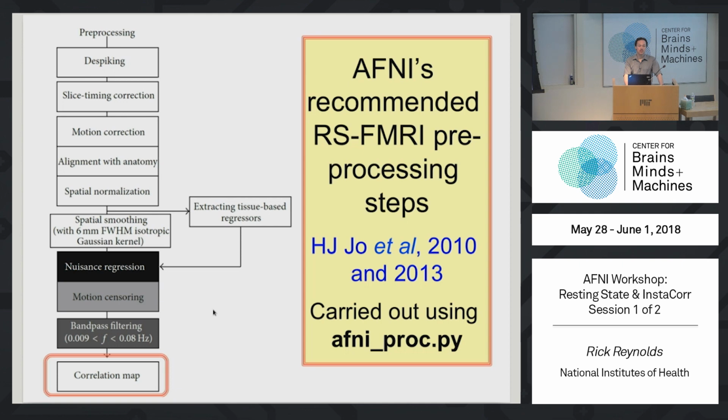Great. If I want to do an ICA, what should I change? Because I did exactly these steps, and then after that, an ICA.